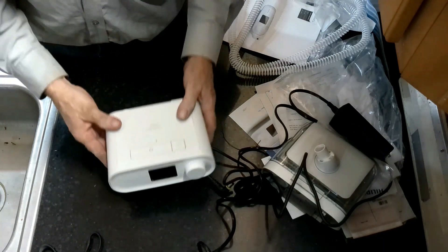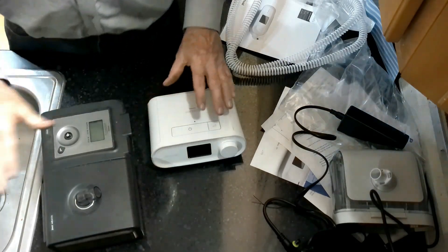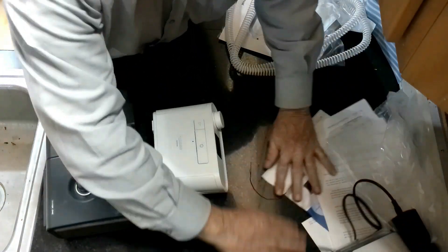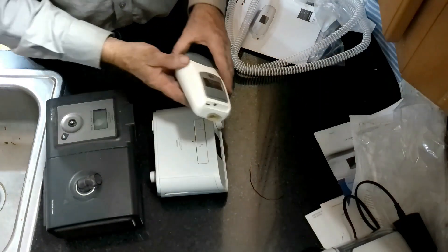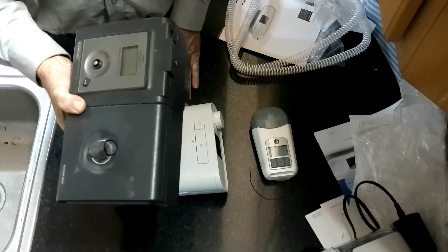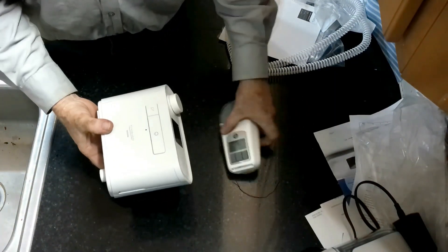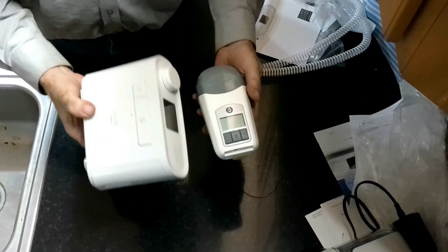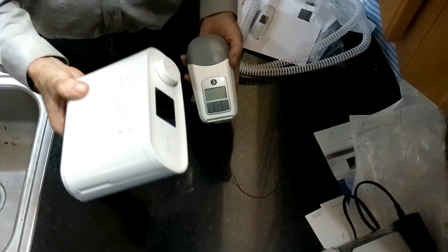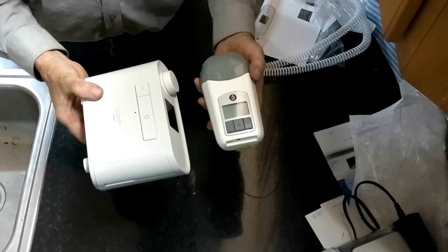The size of this new DreamStation is really interesting. Comparing it to my old one, it's about half the size. What I've been using in the past is my travel CPAP — a tiny thing. If you compare the sizes, the old unit is quite big and cumbersome, and trying to take it on an airplane in checked luggage has always been a hassle, which is why I got a travel CPAP. But with this new DreamStation, it's still twice the size of the travel unit, but much smaller than the big bulky unit I used to have.